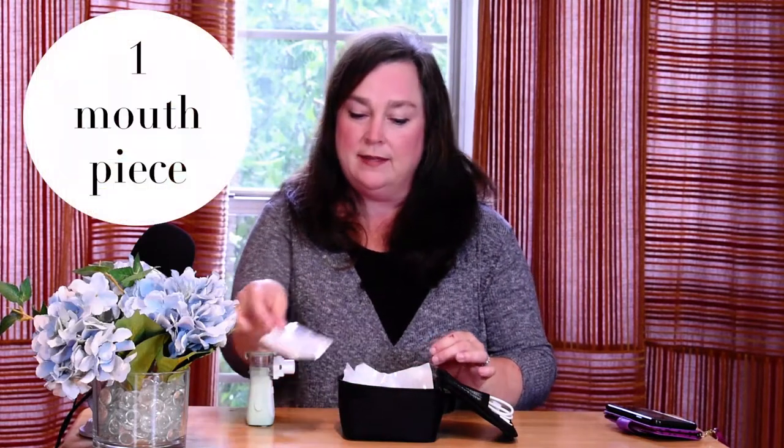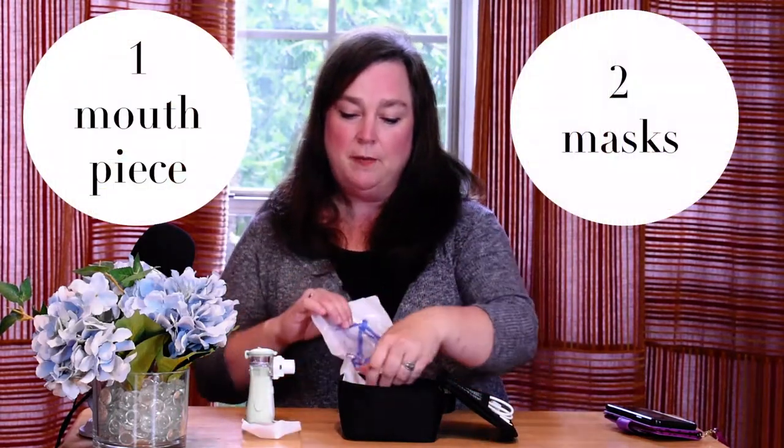This particular nebulizer comes with a mouthpiece and two masks — one is an adult size mask and one is a child size mask. For today's demonstration, I'm going to use the mouthpiece.